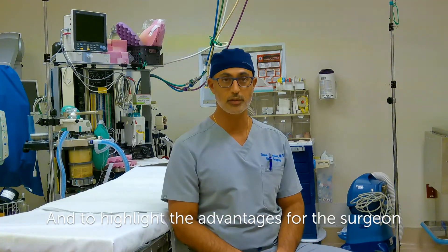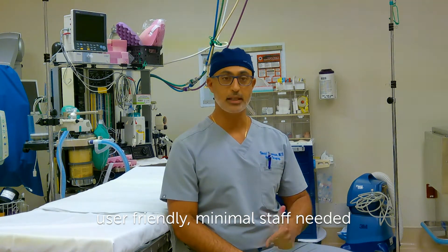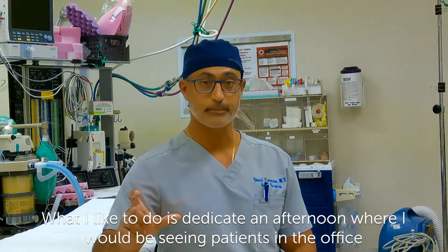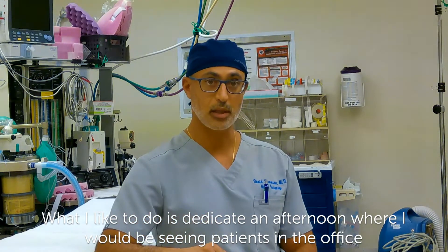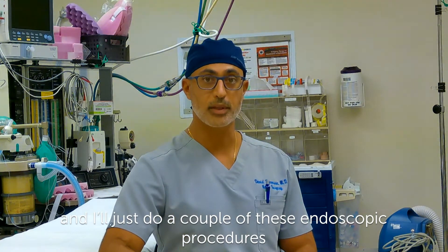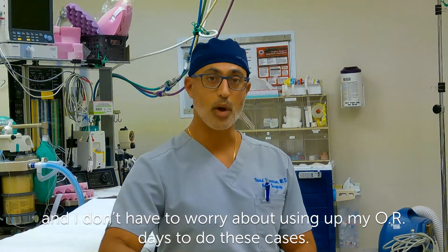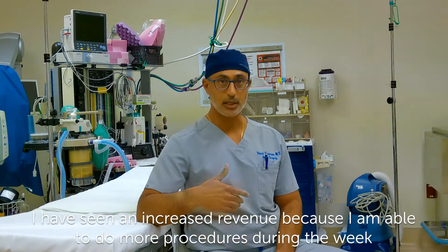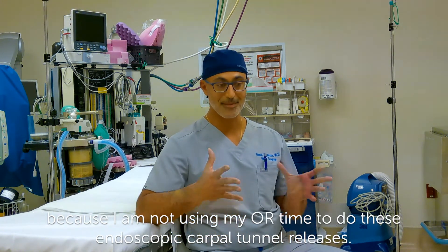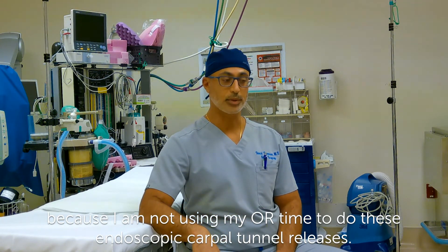To highlight the advantages for the surgeon: user-friendly, minimal staff needed. I could do it on a non-surgical day. What I like to do is dedicate an afternoon where I would be seeing patients in the office and have my PAC patients, and I'll just do a couple of these endoscopic procedures. I don't have to worry about using up my OR days to do these cases. I've seen an increased revenue because I'm able to do more procedures during the week by not using my OR time to do these endoscopic carpal tunnel releases.